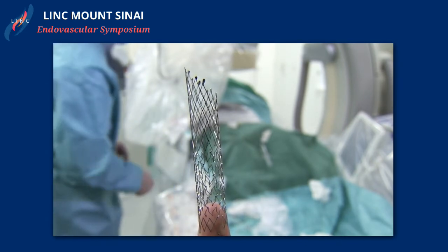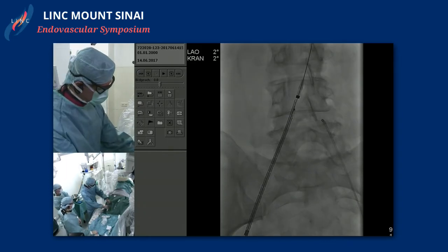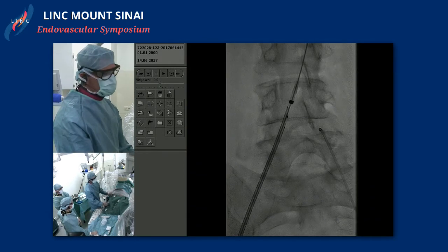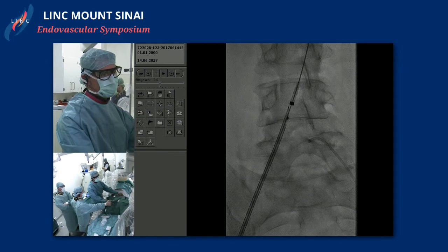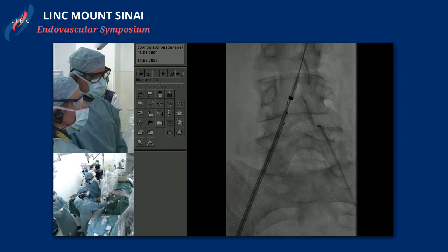A quick question for you about oversizing and sizing with the vessel diameter. What percentage do you size up? For us, we do not oversize. We size the stent according to what we can achieve with the balloon and according to the IVUS measurements.